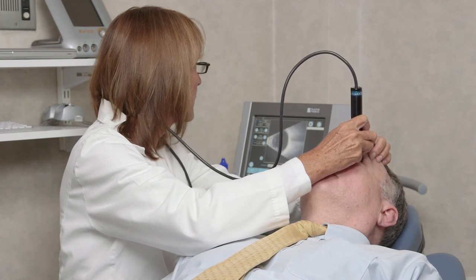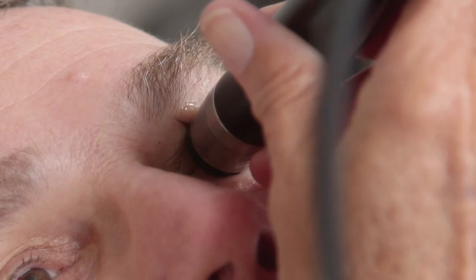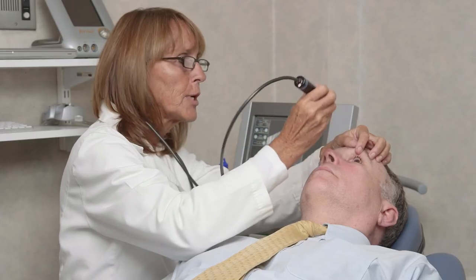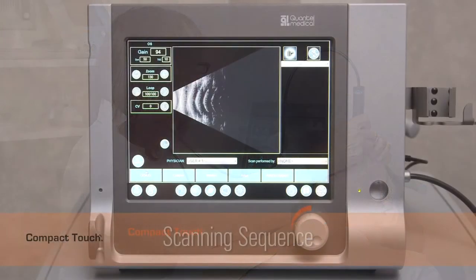There are three directions of axial scan. One: a vertical axial scan is performed with the marker in the superior position. Two: a horizontal axial scan has the marker in the nasal position. And three: an oblique axial scan has the marker up but at an angle. For a majority of patients, transverse and longitudinal scans will supply the needed images.